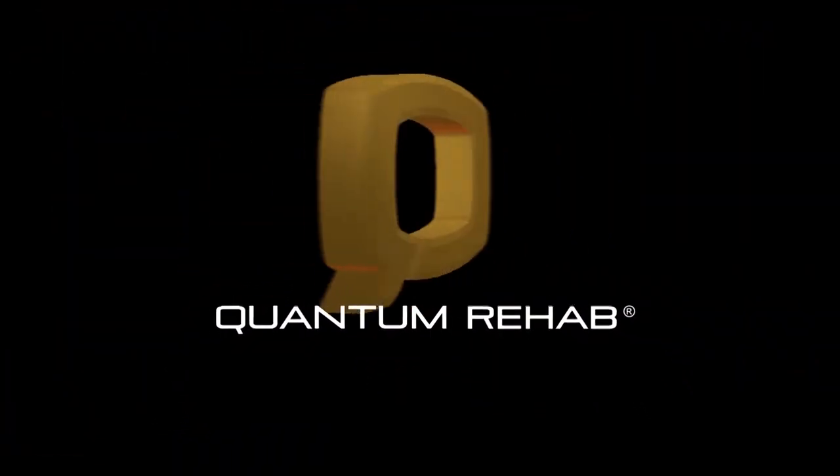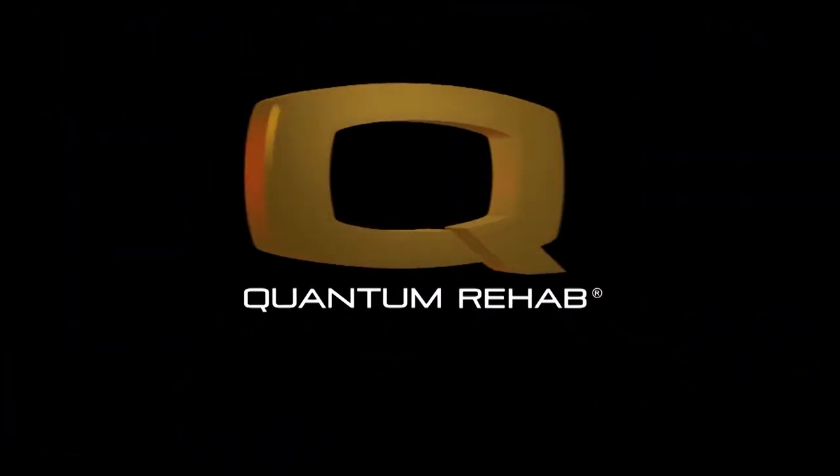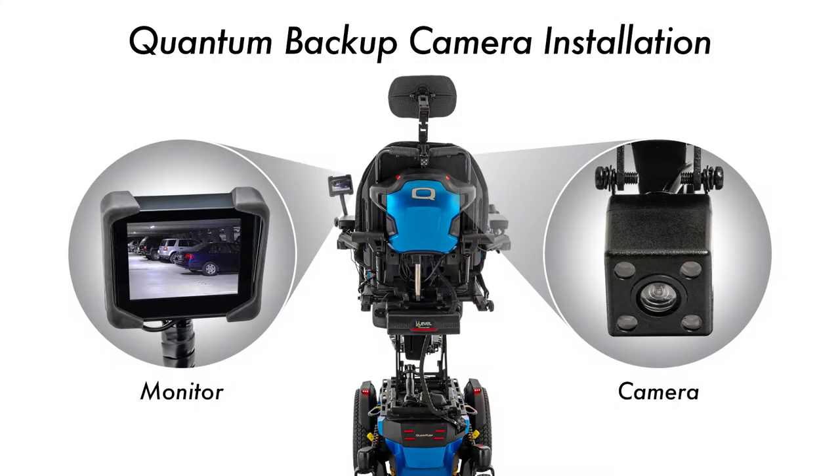Hello and thank you for visiting Quantum Rehab. Today we will be going over the installation of the Quantum Backup Camera, also known as the QBC.